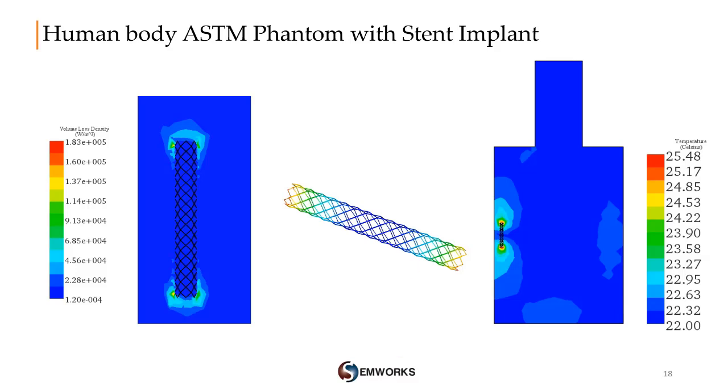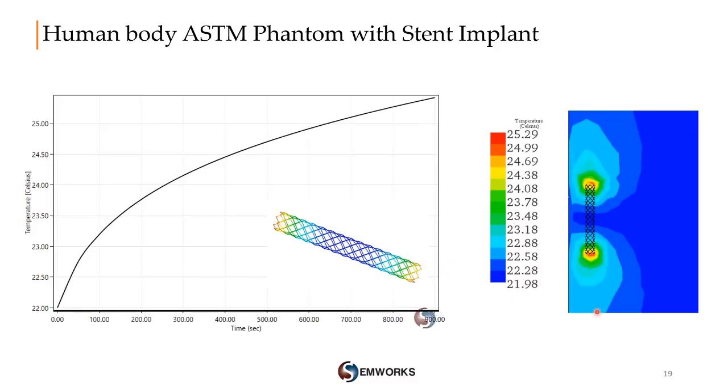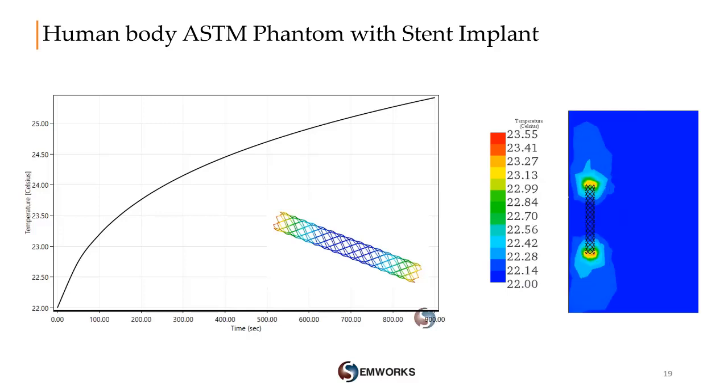So even with these small devices, the generated RF heating by MRI could cause huge damage to human tissues. The following 2D and temperature distribution animation demonstrates the temperature increase step by step versus time. Those results are for a heating period of 15 minutes and could be longer according to the type of the scan done.